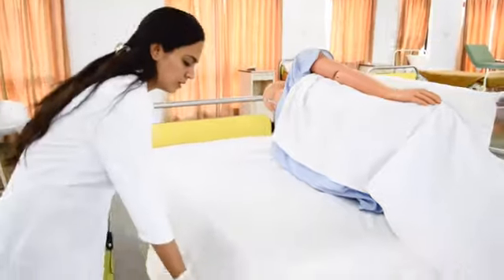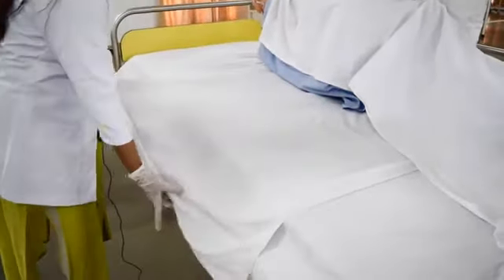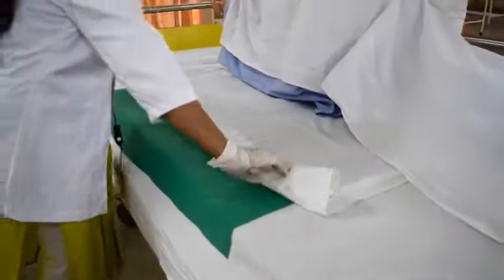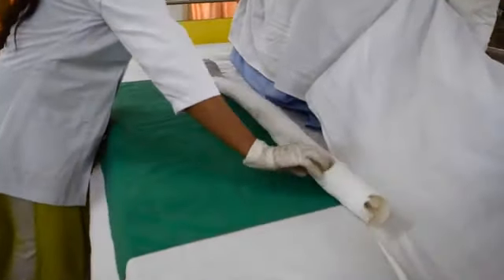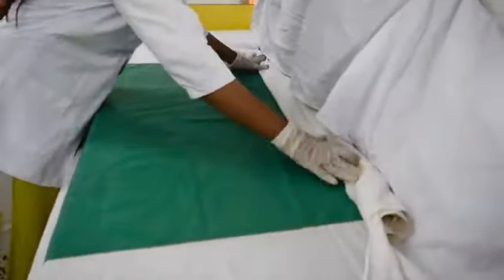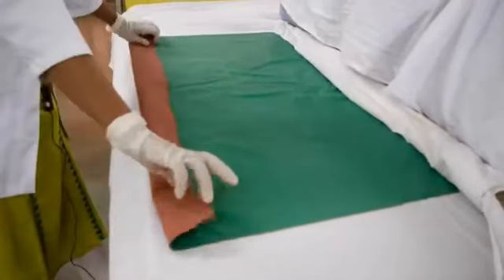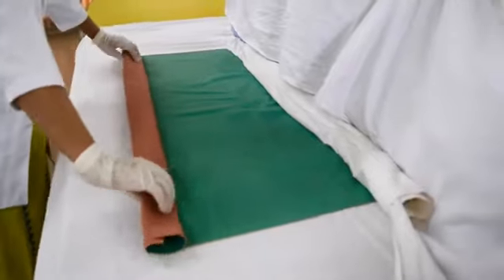Now this draw sheet we have to remove first. Like this you have to roll it, right? Then the mackintosh, roll it like this.